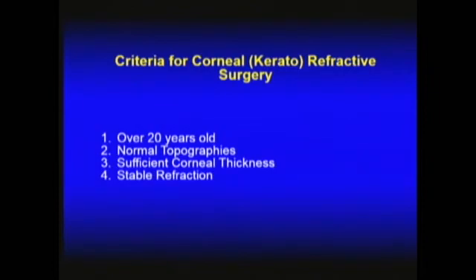Normal, completely normal topographies, sufficient corneal thickness, especially after the ablation. You have to know what is the residual stromal bed that you are leaving. Dr. Barraquer started with 200 microns, then 250 microns, and now I think that the standard is 300 microns, and especially patients with a stable refraction.